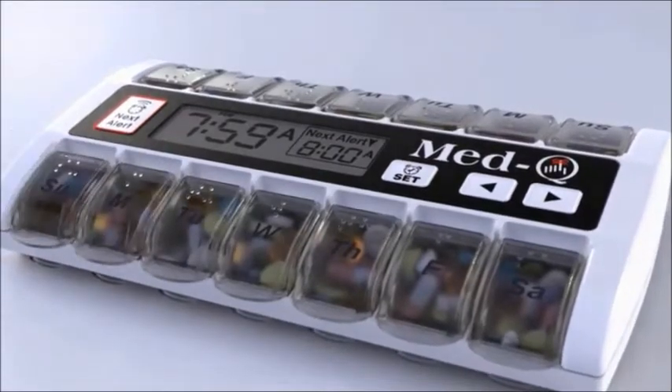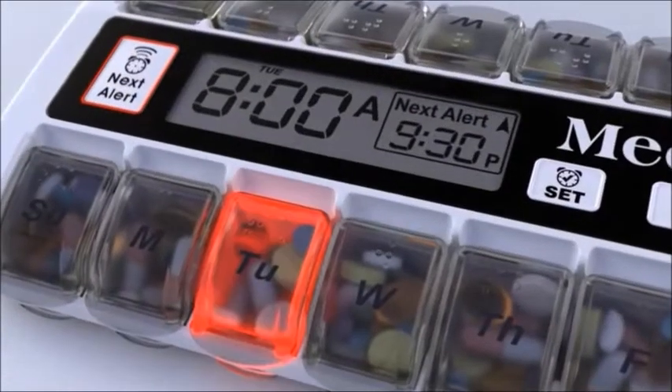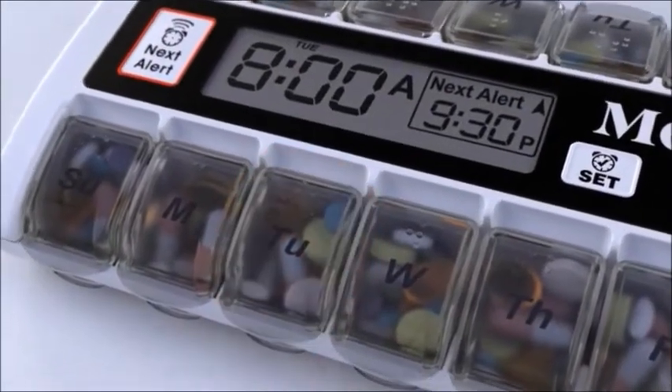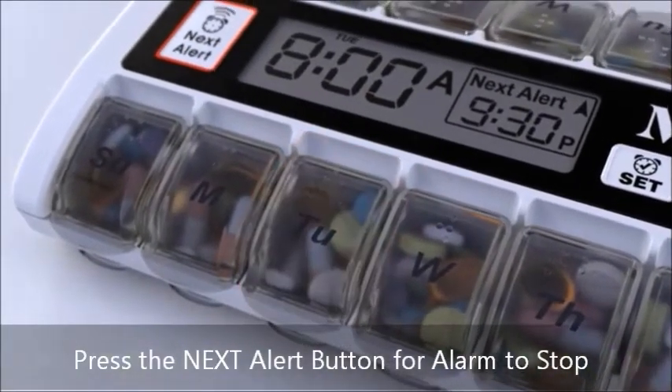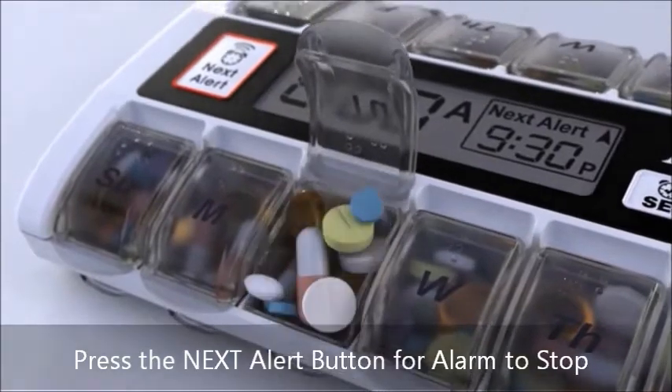Your reminder will alert you with a flashing light and a beeping alarm at the programmed times. A single beep for the blue and a double beep for the ivory white MedQ.